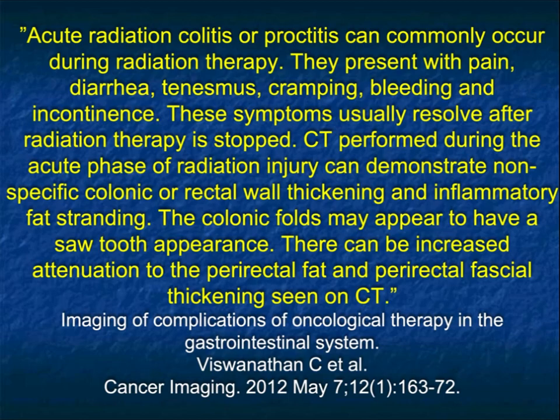Another thing to think about in terms of complications relates to radiation. Radiation complications like colitis and enteritis were more common previously when the doses were higher and the fields were not as select. Now we do this a whole lot better, and so it's rare to see these changes, but it's not all that rare.